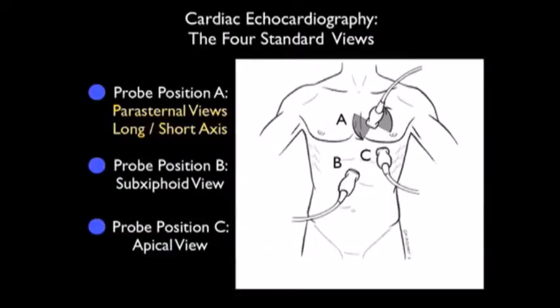In conclusion, I'm glad I could share with you the Soundbites module going over part 1 of parasternal long axis view of the heart. There's a great deal of information that we can gain by looking at the parasternal long axis view, looking for left ventricular contractility, the presence of a pericardial effusion, and also the possibility of right ventricular strain.